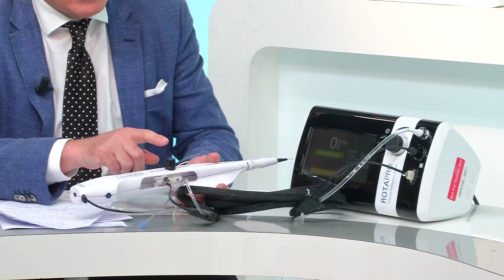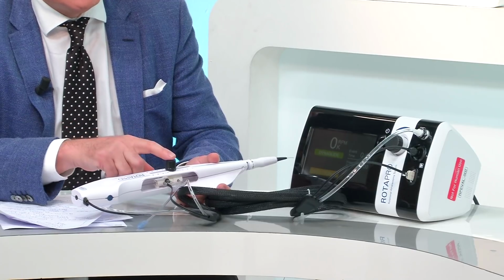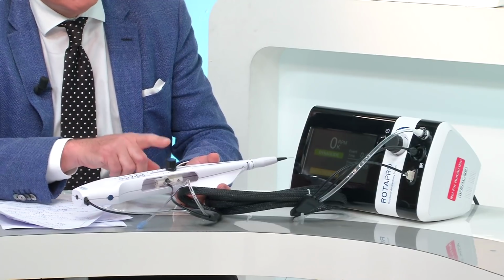What happens if you were on DynaGlide and you press the main button? That's a good question, because there is a safety mechanism. So even if you are on the DynaGlide and you push on this button, nothing will happen. This is a safety mechanism. So sometimes the despondent staff who have to get the whole kit out for rotablation, in fact, this can just be relatively straightforwardly kept on a simple console.